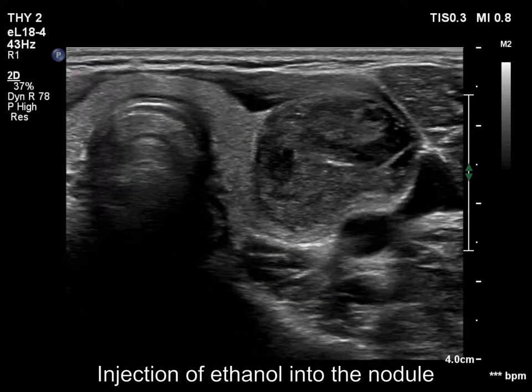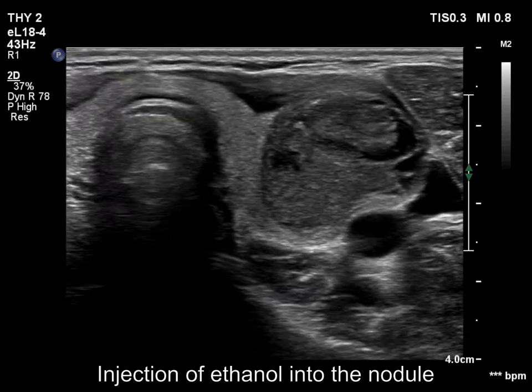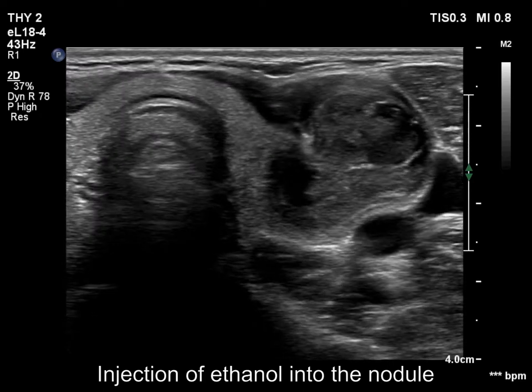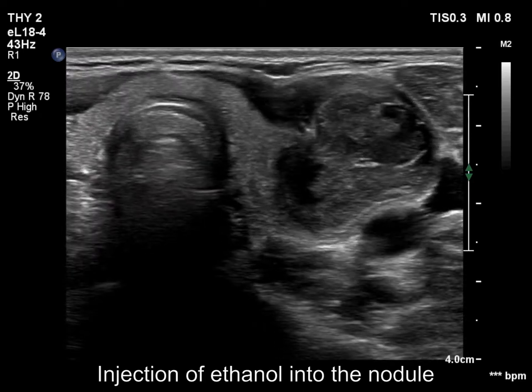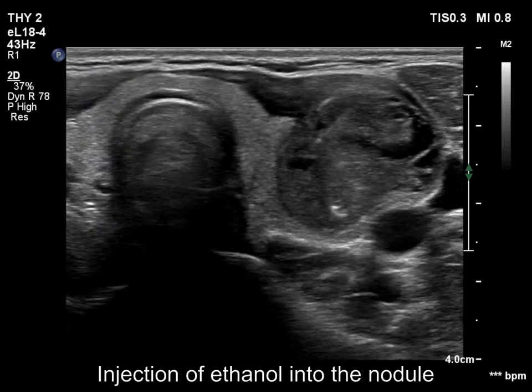Now, the phase of the ethanol injection. We insert the needle into the medial part of the nodule, far from the carotid artery, and start with the treatment.